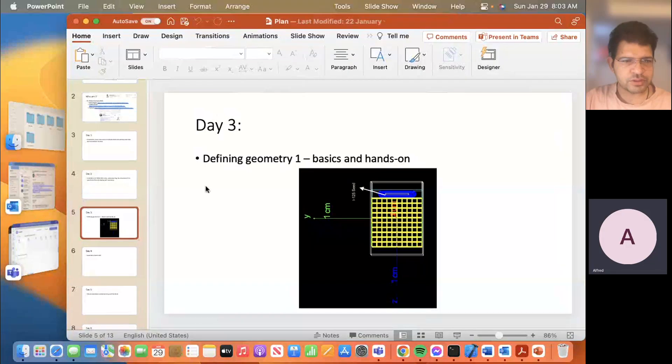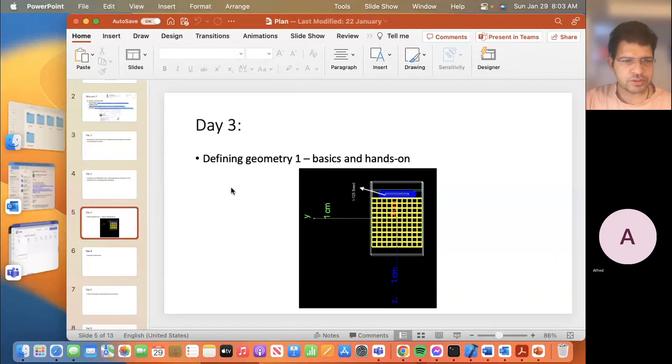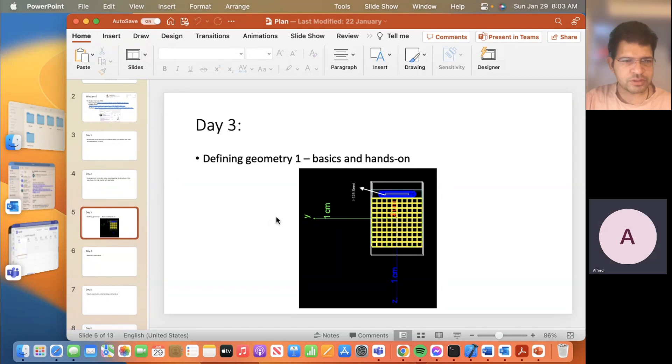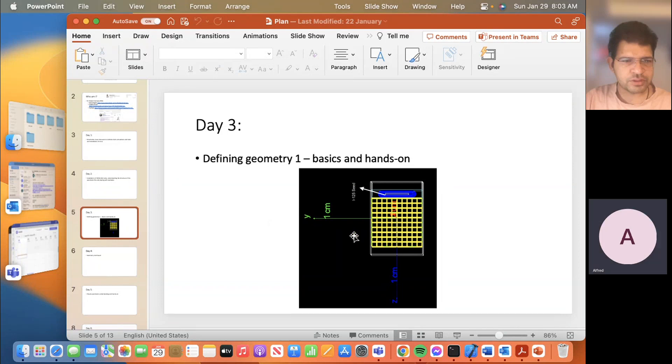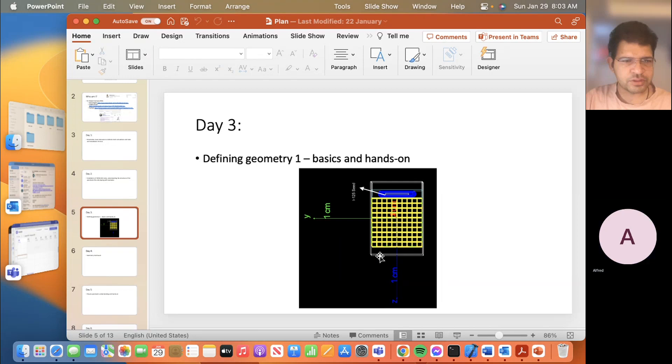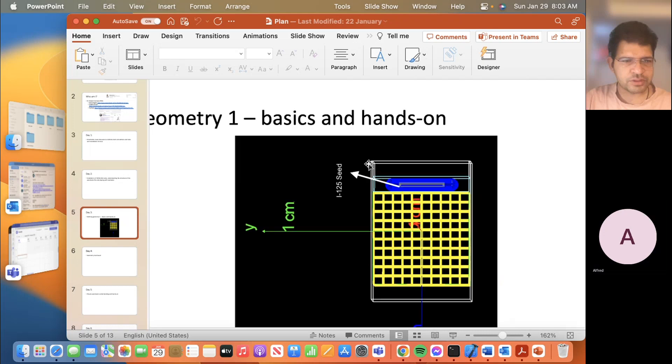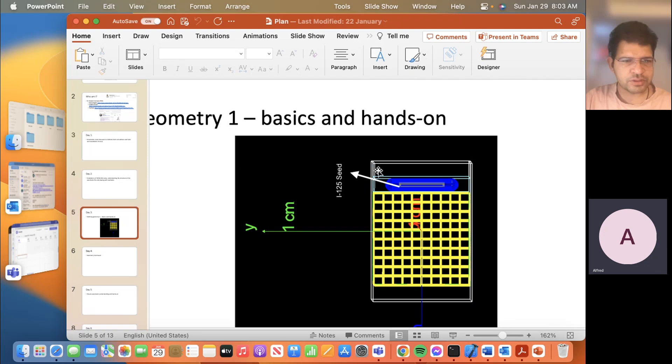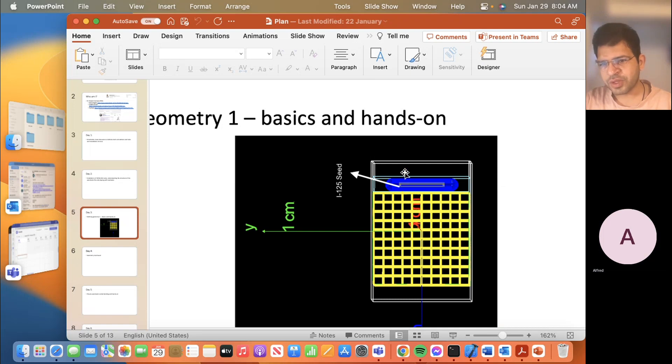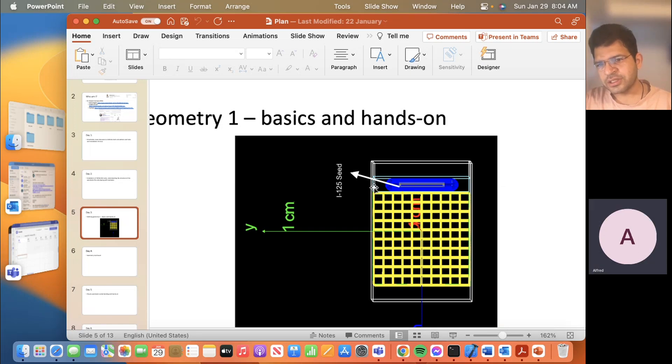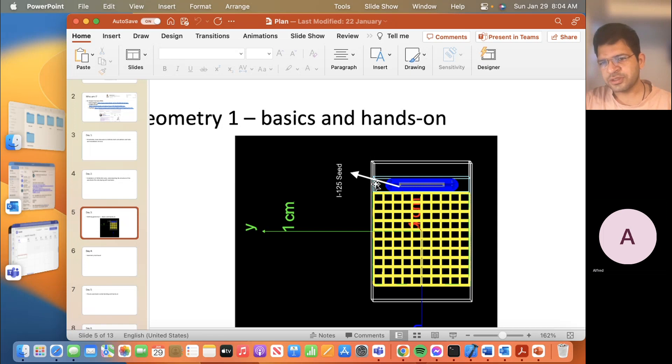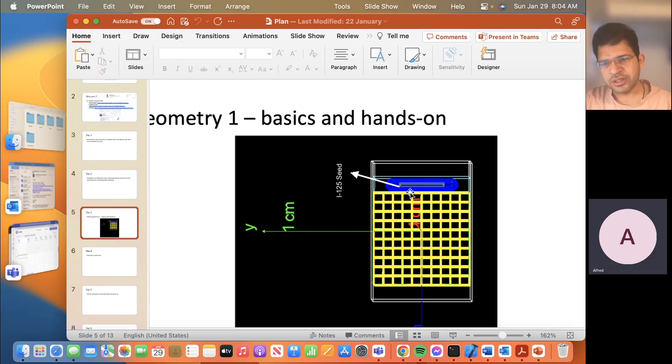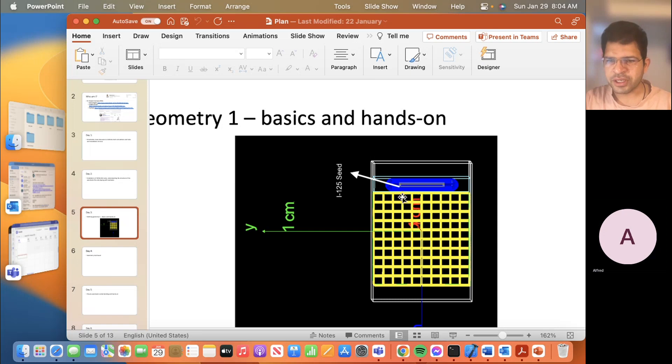What we are going to work on is defining your geometry and how you will be doing your own simulations. For today's workshop I have devised this basic model where we have this outer white box as the world box, and above this white box is another box acting as a lead shield. This sandbox is filled with air and in this air there is an iodine-125 seed or co-seed that is used for LDR brachytherapy.